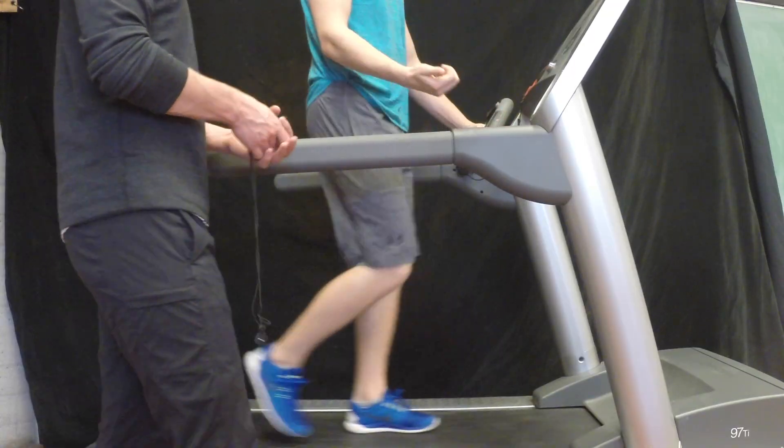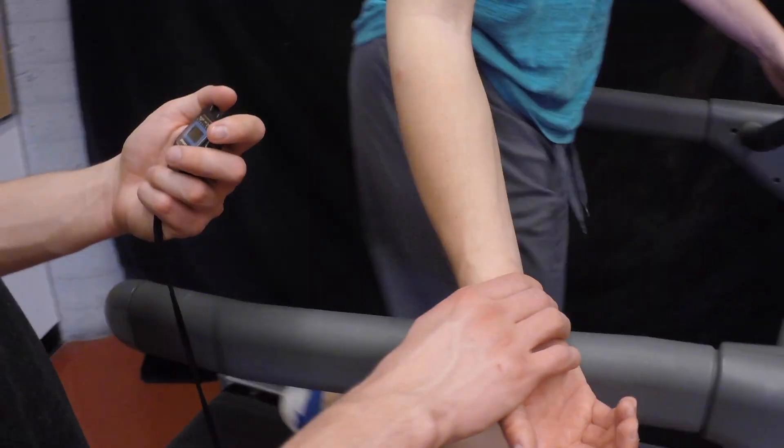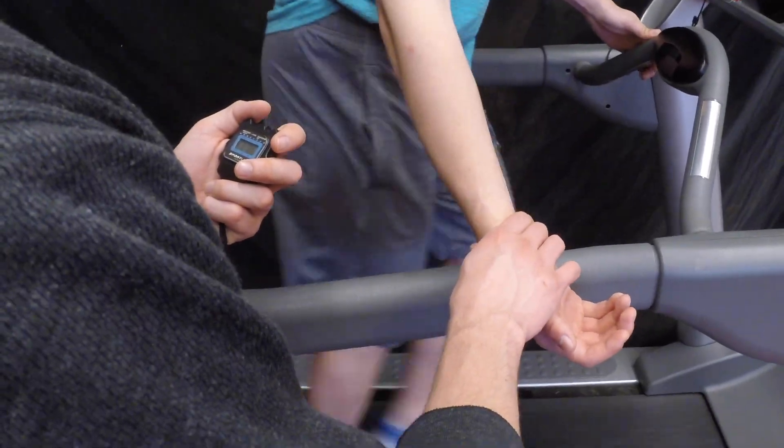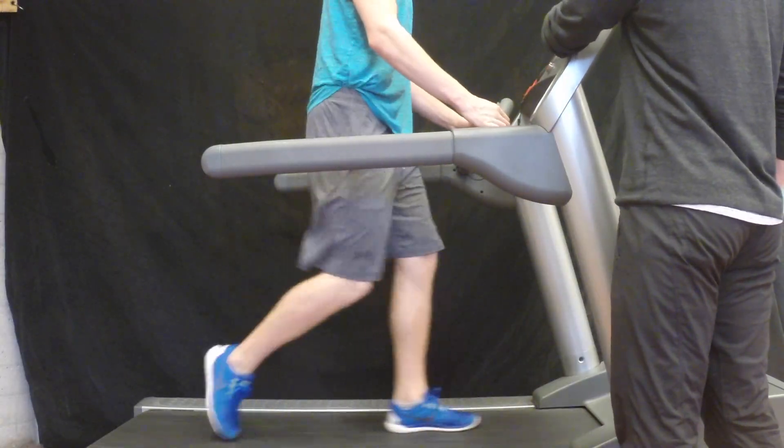Now when the 4 minutes is up, take their radial pulse. If the heart rate is not within the 50% to 70% range, then increase or decrease the speed accordingly and continue with the test.